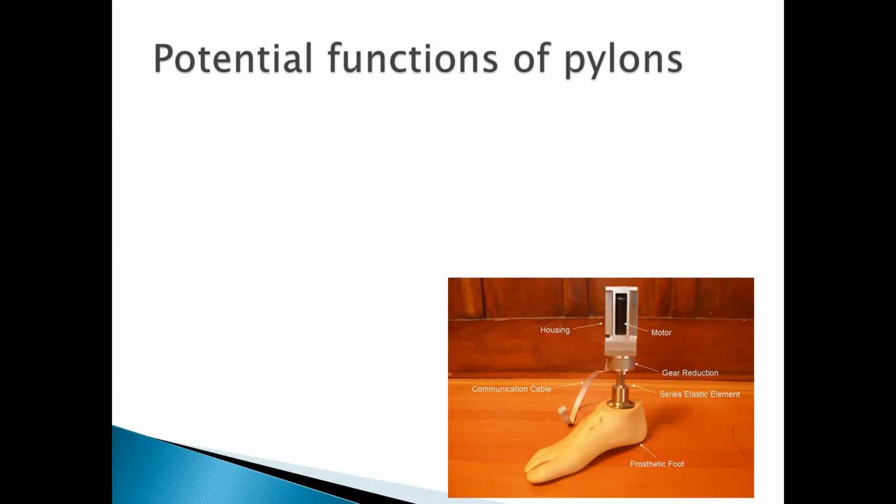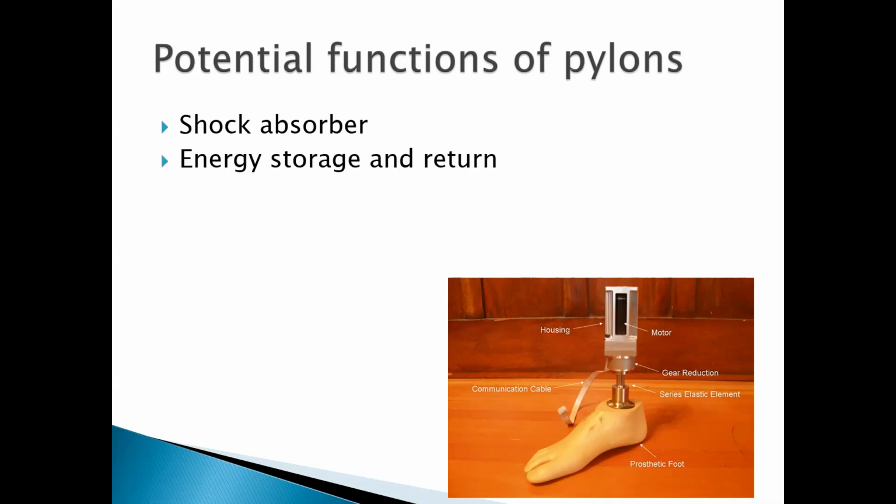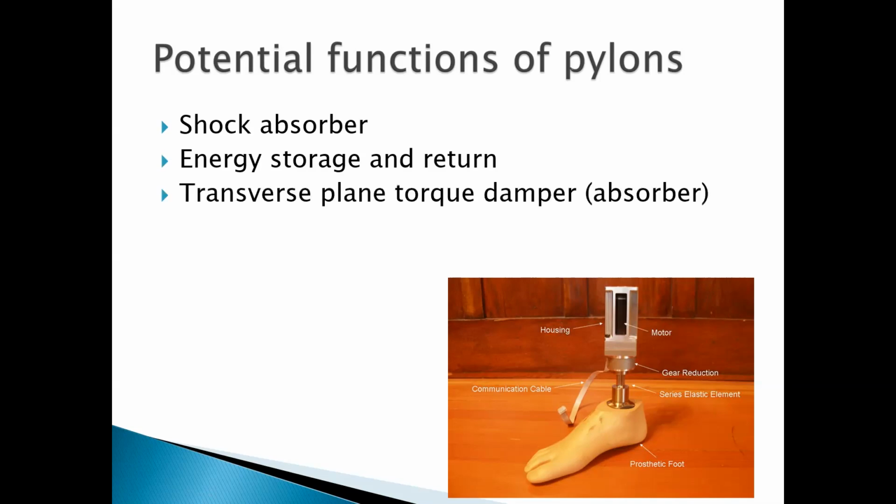And some really important things can be built into a pylon. So I'll talk about that a little bit. So you can have a shock absorber, energy storage and return, like we were just demonstrating. And what you see here is a transverse plane torque damper. So this actually has an electronic system for transverse plane torque dampening and shock absorbing. But I'll show you actually something more.